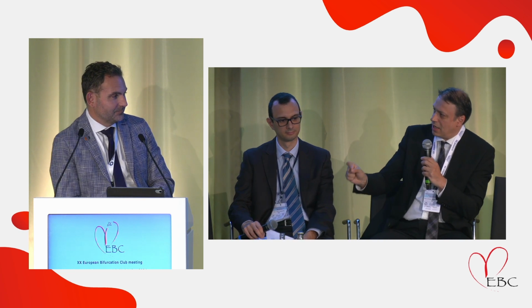To ask you about calcification, calcified plaques. You have tried it and you have a better understanding. Do you see any problem when you have a calcified lesion in finding the struts? And the second question has to do with apposition. You can definitely assess malapposition with confidence, but when it comes to embedment and apposition, what's your experience by using this approach? Because this can have some effect on the Chiastra.